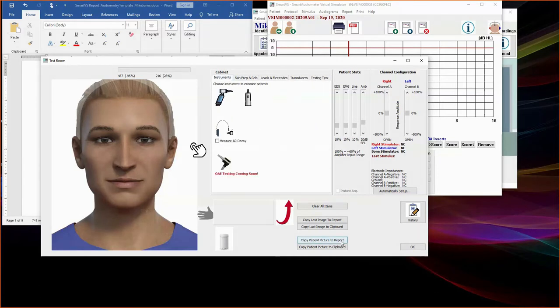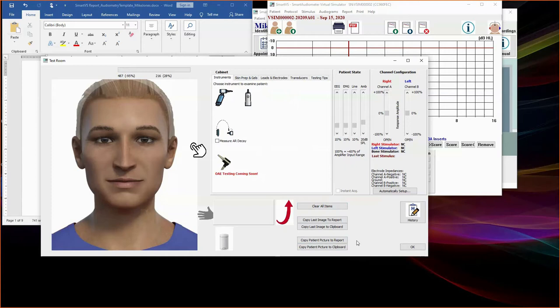Click on the copy patient pictures to clipboard and paste onto your report documentation program. Before we begin testing, please note more measurement instruments, supplies, electrodes, and stimulators will be added to the cabinet as SmartVS is expanded in the future. From the operational point of view, if the instrument used for testing is placed incorrectly or eartips used are the wrong size, you will see a message such as too loose or ouch generated by the patient.